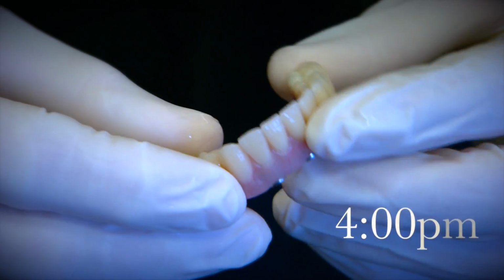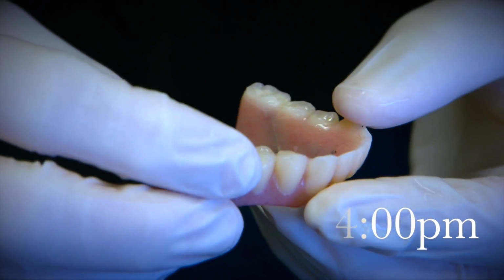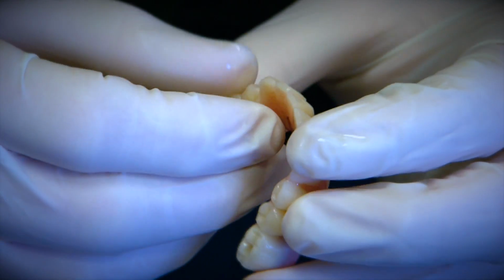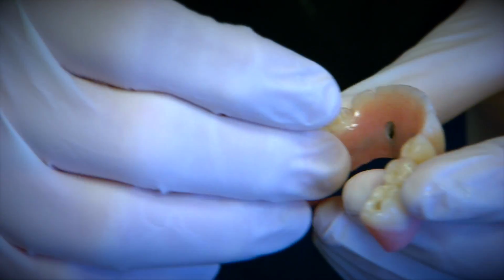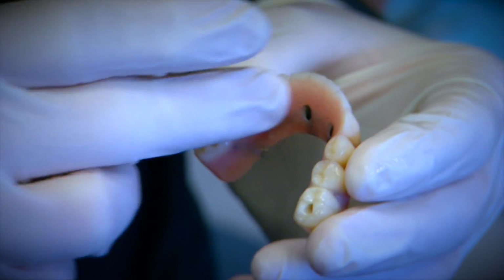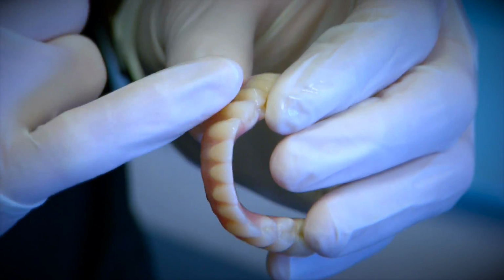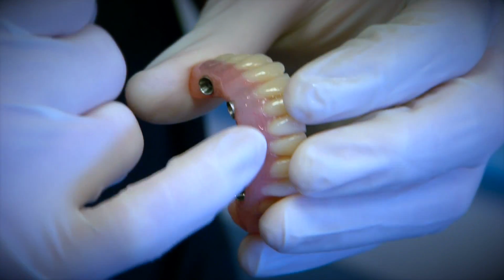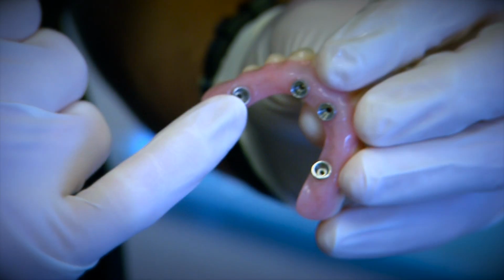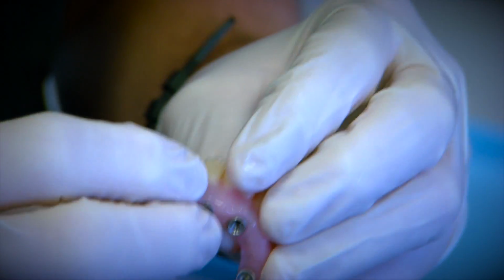So here is the completed all-on-4 bridge. It's 4 p.m. in the afternoon, and this has come back from the technician. Our patient's been recovering since 11 in the morning and is still numb and in no pain at all. What we're doing, this is the bridge. The all-on-4 bridge not only replaces the teeth, but also replaces the missing gum and the missing bone. You can see 1, 2, 3, 4 where it's attached to the dental implants inside the patient's jaw.